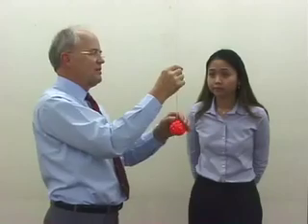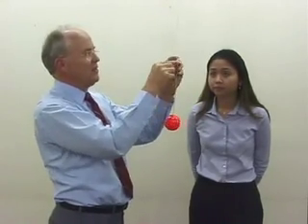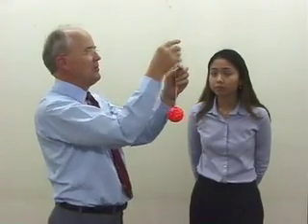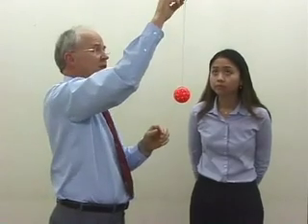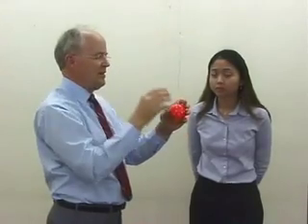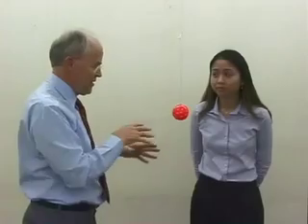This ball has a little device, a little circular plastic button with 2 holes drilled in it that makes it a nice device to be able to move it up and down like so. So you're going to be taking a ball like this home and hang it in a prominent place, some place where you'll have lots of space around it. Because later on you'll be walking around the ball and you'll need a little more space.